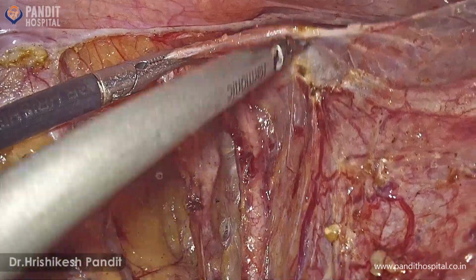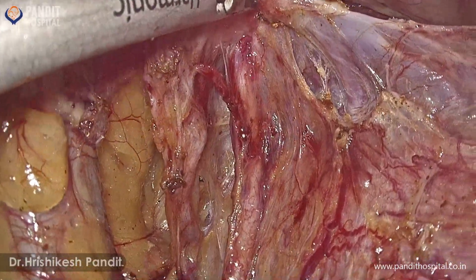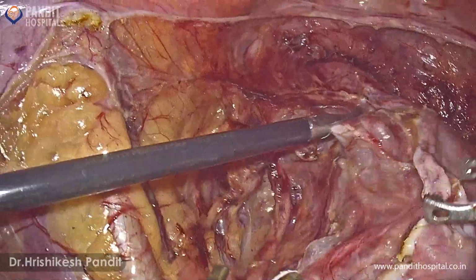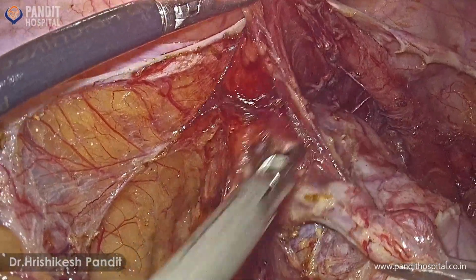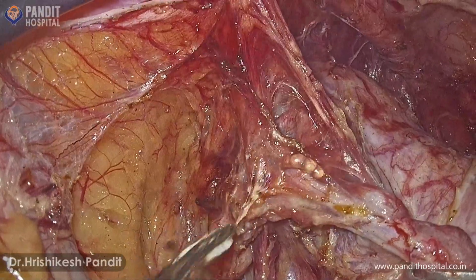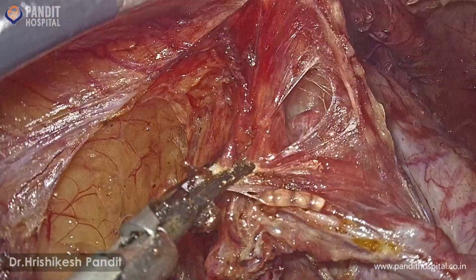The vascularity of the uterus is maintained till the entire pelvic ureter is dissected, because if we have to decide the case to be inoperable when we cannot dissect the entire ureter, in that case maintaining the entire vascularity of the uterus is helpful in giving radiation to a cancer cervix patient, as radiation acts better with intact vascularity.